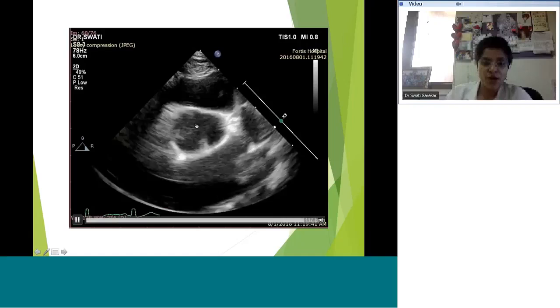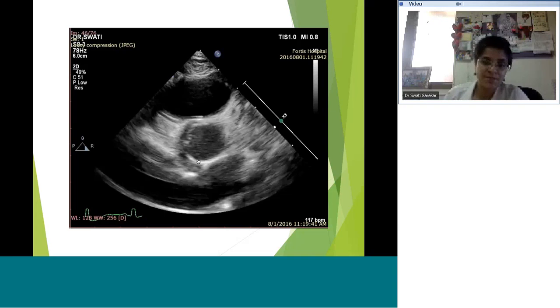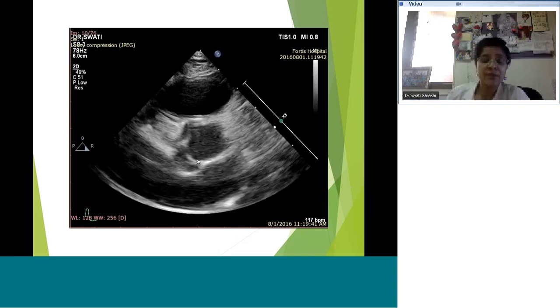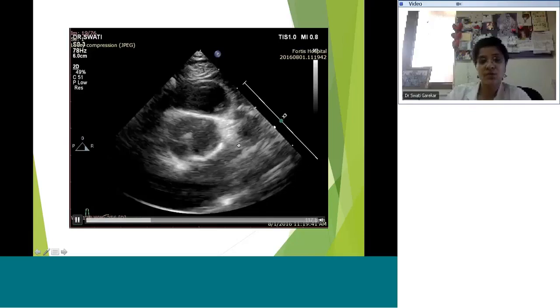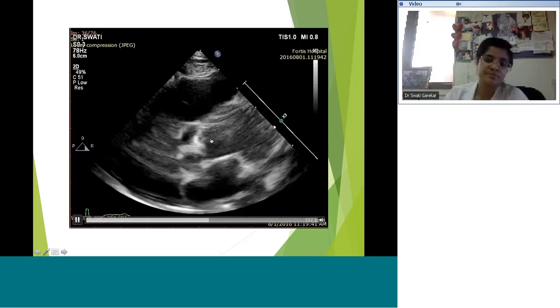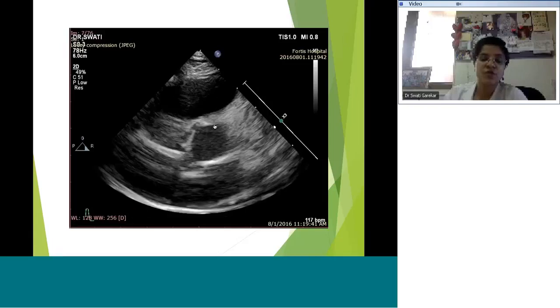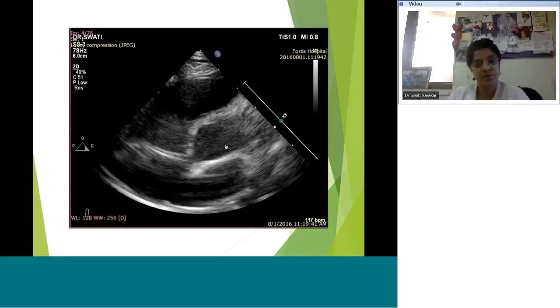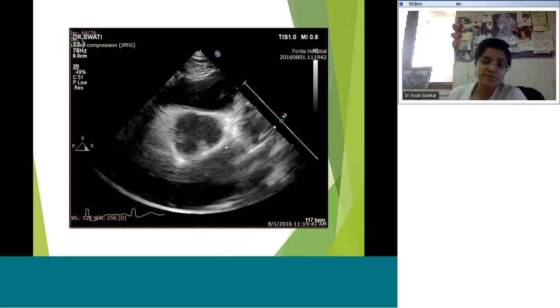Now this aortic valve is a functionally bicuspid aortic valve. It happens 30% of the time, and this is worse than the other subset, which happens the remaining 70%, which is fusion of the right and the left cusps, where that elliptical orifice is not oriented at 12 o'clock, 6 o'clock, but rather at 3 o'clock, 9 o'clock, the fish mouth that we see. So those valves tend to be a little better. So when I see such patients referred for murmur, and if I see the common variety, I'm a little bit more optimistic, because obviously you know that this means lifetime follow-up.